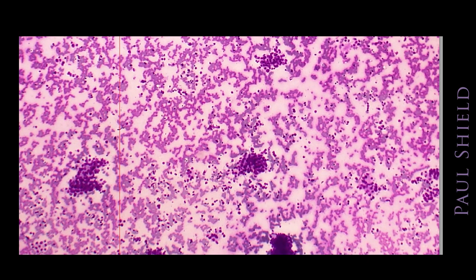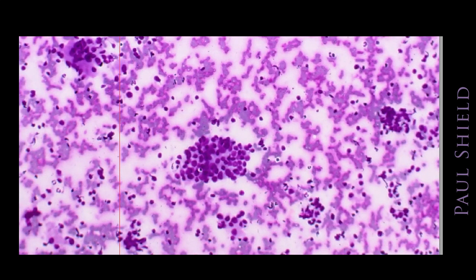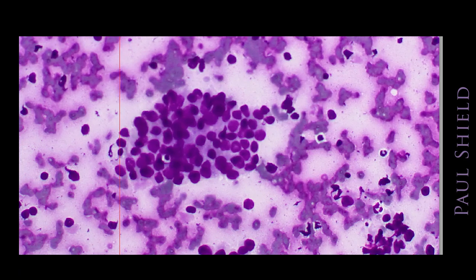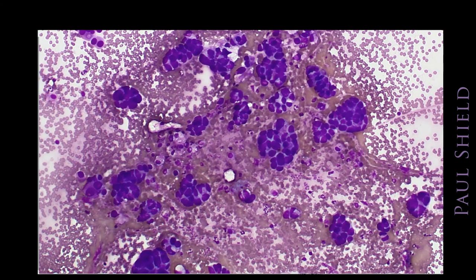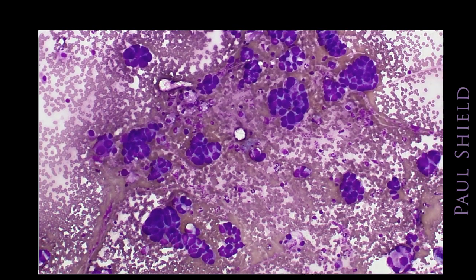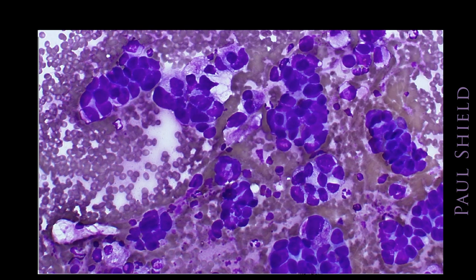Here's an example, and you can see even at low power on this specimen that has a lot of blood in it, that there are cohesive groups of epithelial cells. So we're dealing most likely with an adenocarcinoma or some other type of carcinoma. You can see there are some little groups, and these are background lymphocytes, the single cells mostly. But most of the epithelial cells, the tumour cells, are looking quite cohesive. This is another area of the slide, and you can see they're forming these balls of cells that seem organised and quite cohesive, so they're holding together.